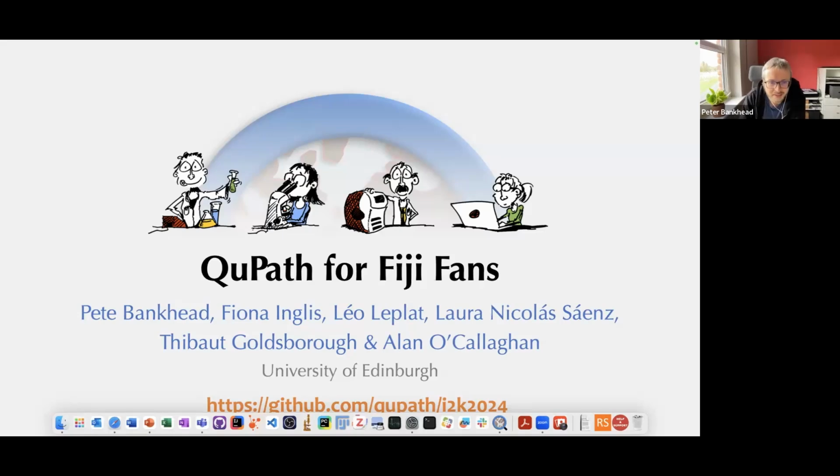We can start and see how it goes. So thanks for joining. The subject of this workshop is QuPath for Fiji fans.